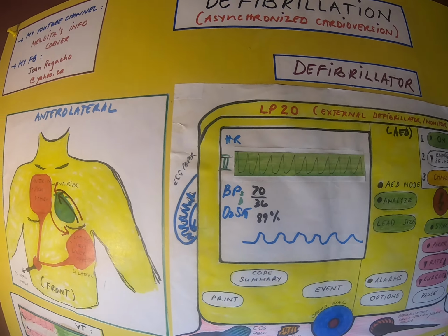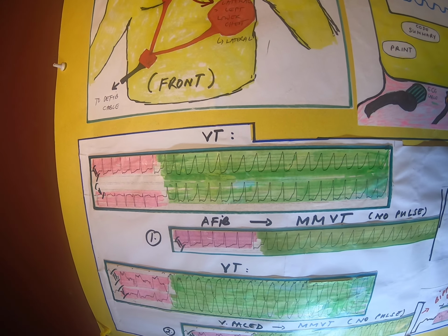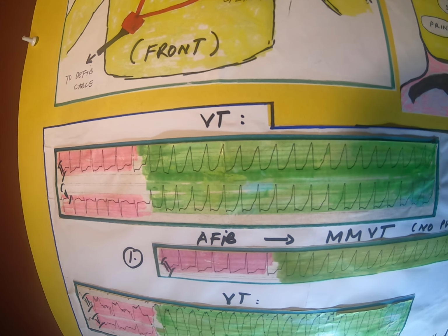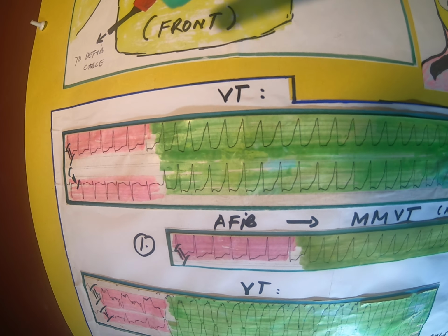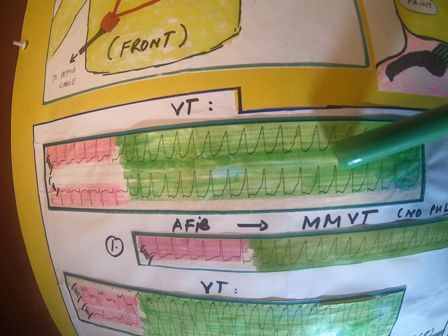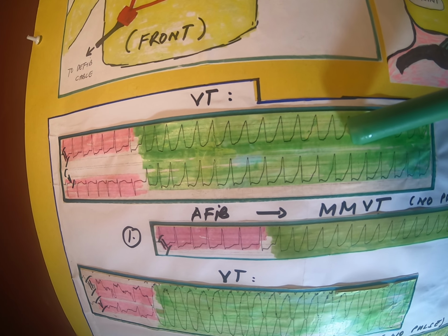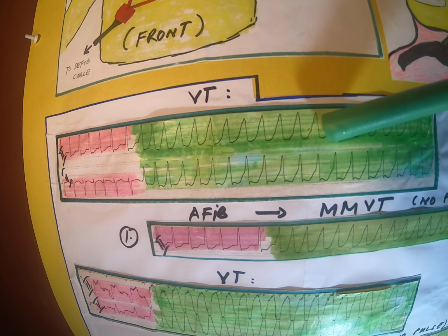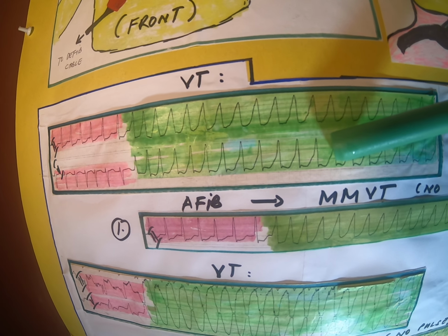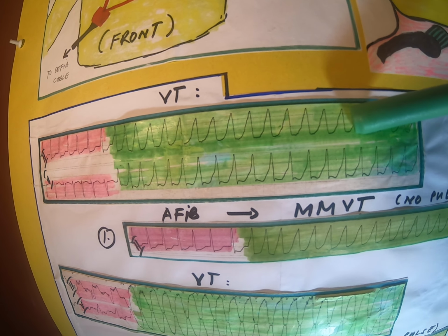So you are in CCU. Suddenly on the central monitor, you see that your patient with atrial fibrillation went into wide complex tachycardia. I give you two examples here. The CCU RN will rush to the patient's side and notice that the patient is not breathing and has no pulse, will hit the code blue button on the wall, and then start CPR.